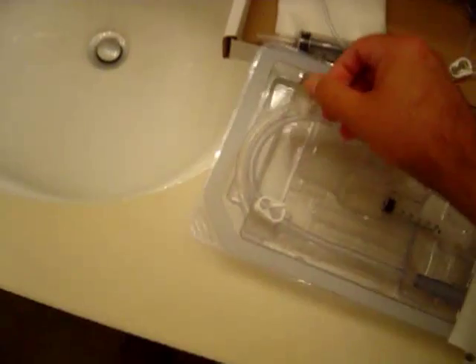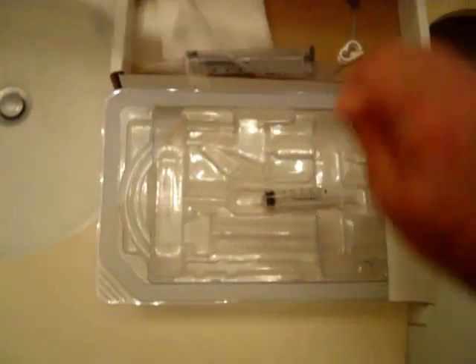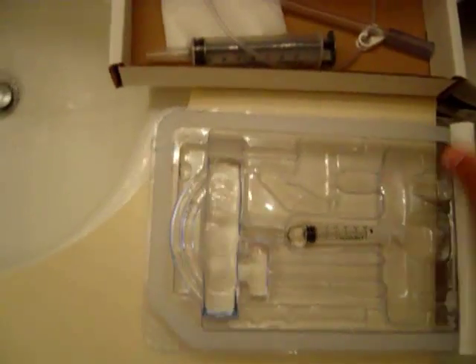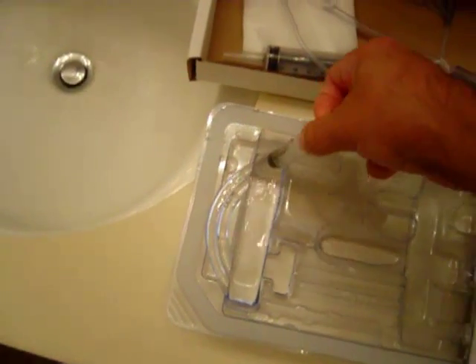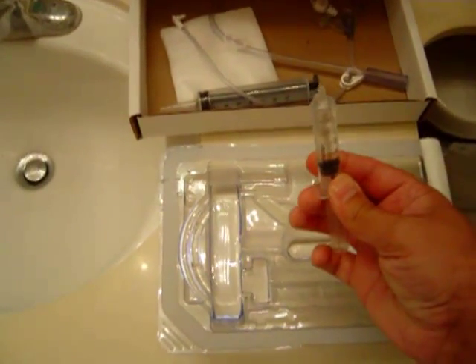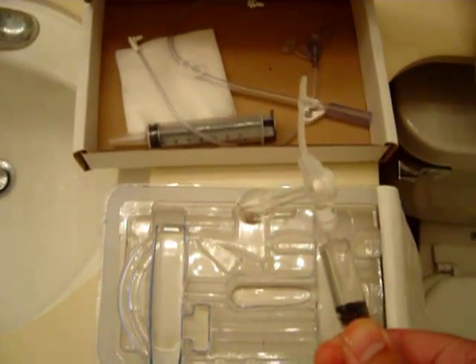I'm going to put a little bit of water into the kit here and draw up about 5cc's in the syringe for the balloon. You definitely want to test the balloon before you do anything because every once in a while there are manufacturer defects, so just put in the 5cc's and test it.